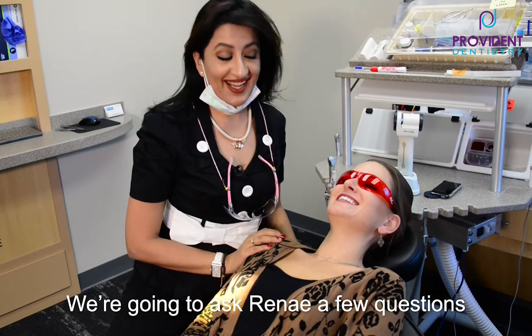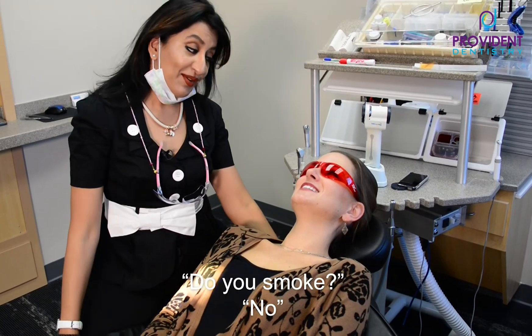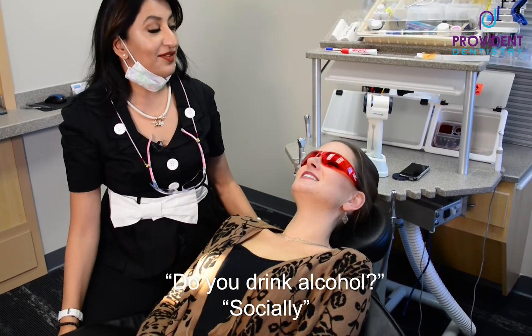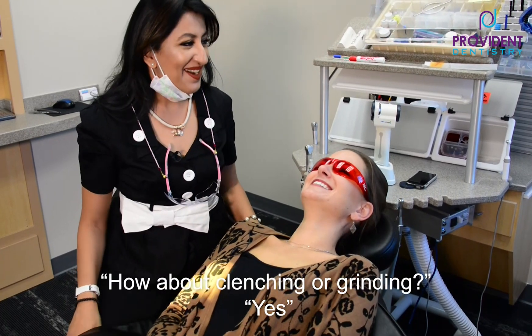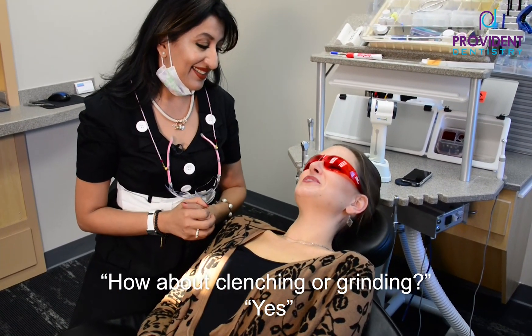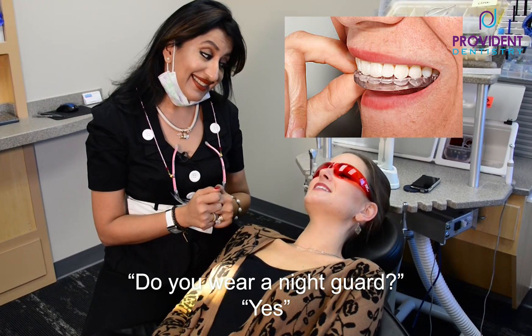So Renee, she's my patient today. I'm going to ask you a few questions. Do you smoke at all? I do not. Do you drink alcohol? Socially. How about clenching or grinding your teeth? I do. So when you clench or grind your teeth, do you wear a night guard? Yes. Perfect.